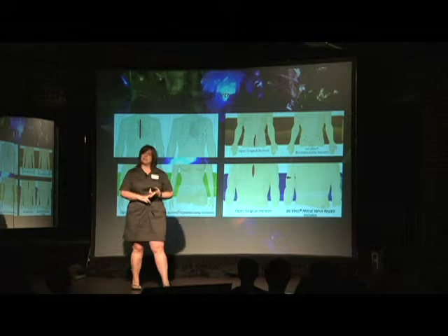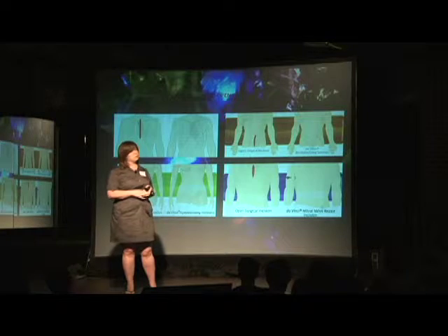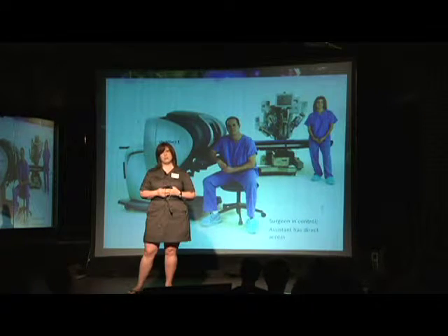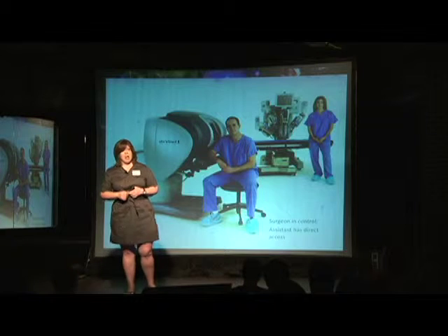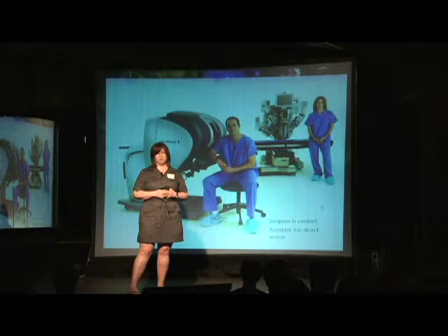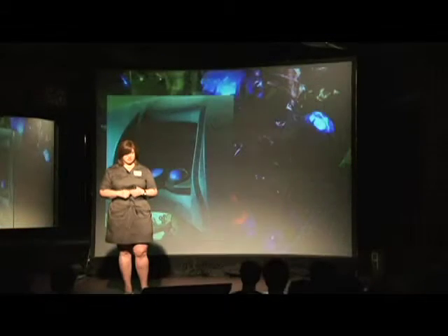And we do prostatectomies, we do hysterectomies, we do colon resections here in Tulsa. In Oklahoma City, we do several heart procedures, and that's really nice, not to have to crack the ribs open in order to get those done. I expect that we're going to get a heart surgeon that is robotically trained within the next 12 months here in Tulsa. Here you see two of the three components.